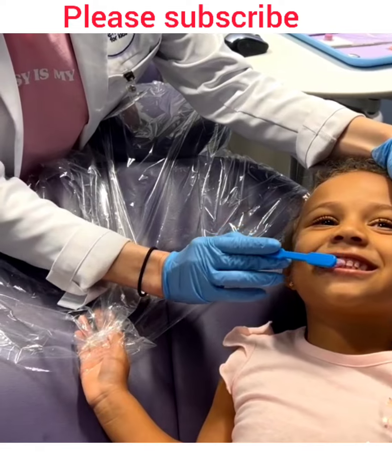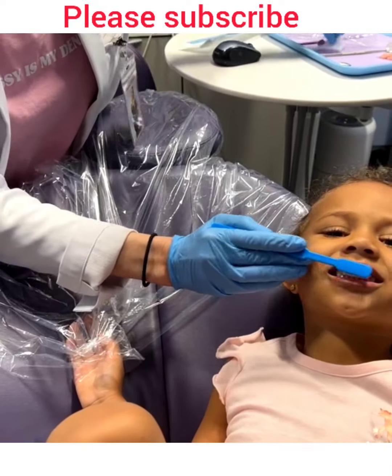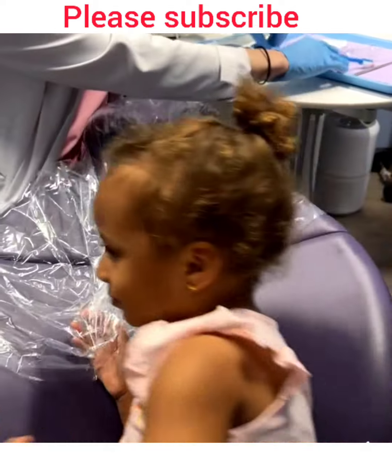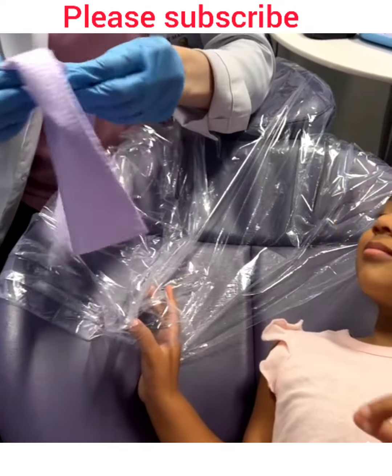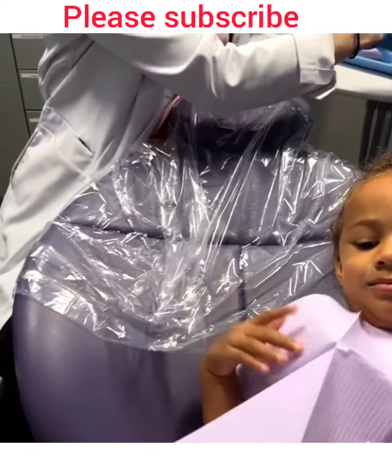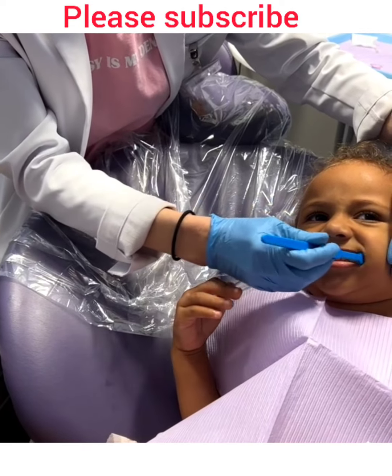A little tickly — that's okay! Want to wipe it with a little towel? Let's put a little napkin, June. You want to stay down — stay down, my love. You're being very helpful. You're being really good, June, I'm proud of you. Let's wash your teeth in the back — oh, bless you!